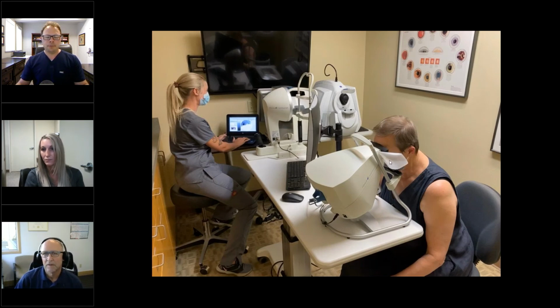And if a patient needs a Smartfield and they have contact lenses that are the proper prescription, their contacts are in their eye, they just go do the test. It's set at distance. So if they've got an adequate distance prescription, glasses or contacts, they can just step up to the machine, put their head in, and they're off and running without a trial lens. Right. I didn't even take that into consideration when I did the study. Yeah, so we have to redo the study. We do.